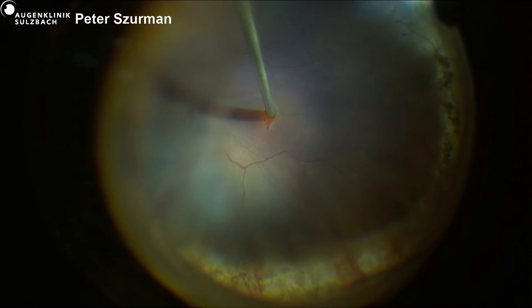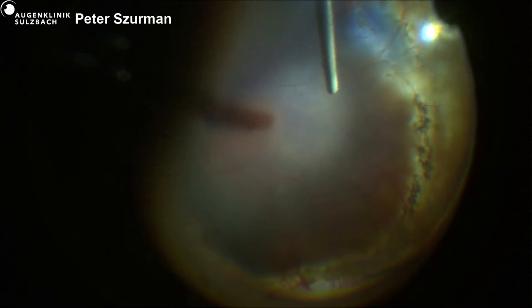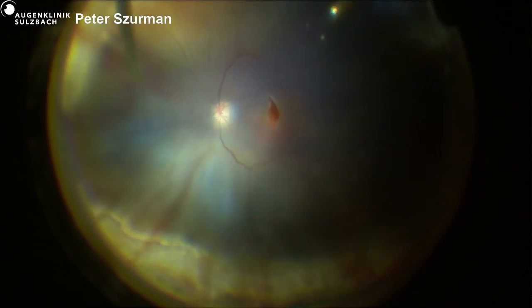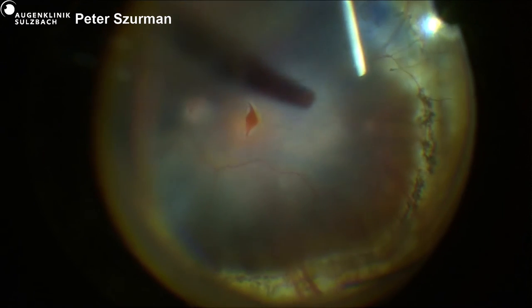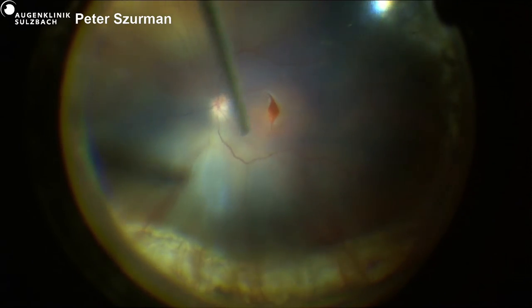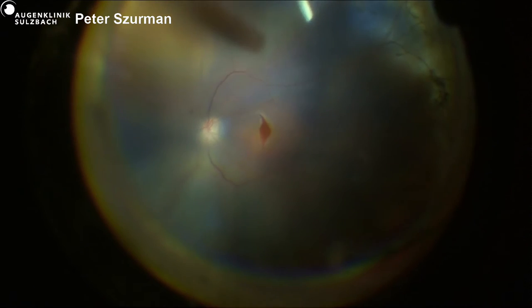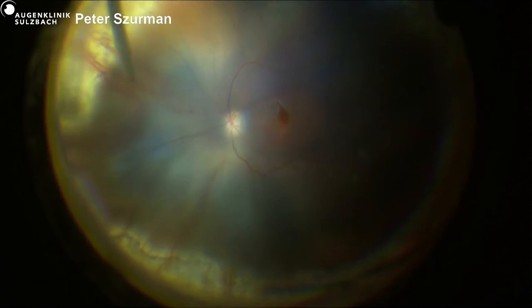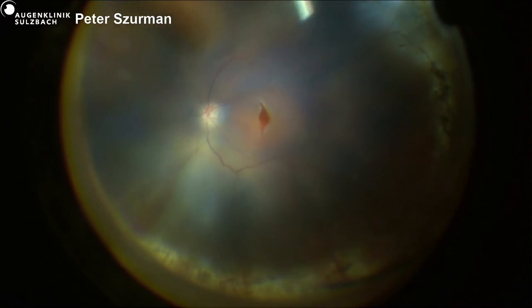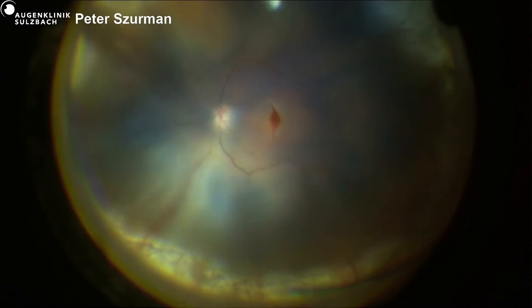So passive suction. You know, I've never done a direct comparison, but my impression is that viscoelastic is better for excluding than using PFCL, because the PFCL can roll around and get in, whereas the viscoelastic will stay there. But I have not done that comparison. Have you done that comparison? I always fear that viscoelastic goes through the hole into the subretinal space, and then of course it's a disaster in my opinion. Why is it a disaster? Because it stays there for some days. But he's going to patch over it anyway. Well, I have no experience with patch. So you're taking us into unknown territory, Peter. We are going into the unknown here with this case.